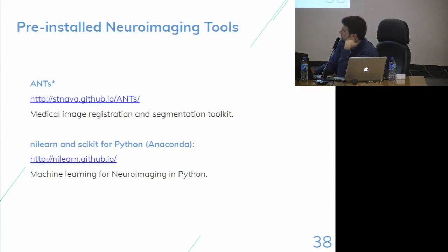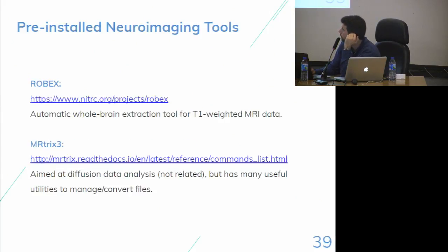Then inside the image, as I said, you will have all the ANTs binaries, all the ANTs programs that produce segmentations and cortical thickness. You'll have all the Python packages, like Nilearn and scikit, that produce the regressions and the model trainings that I showed before, and you will also find all the notebooks that I've been showing, so everything is in there.